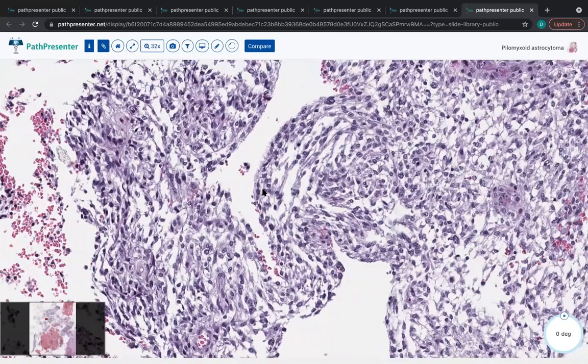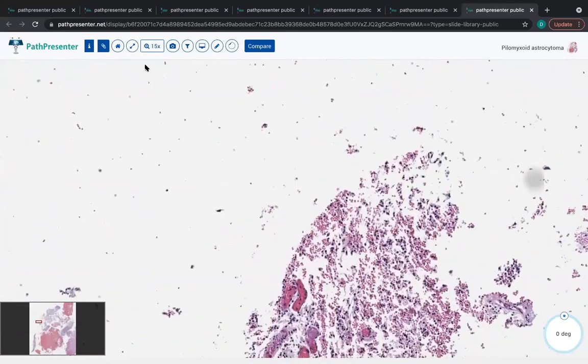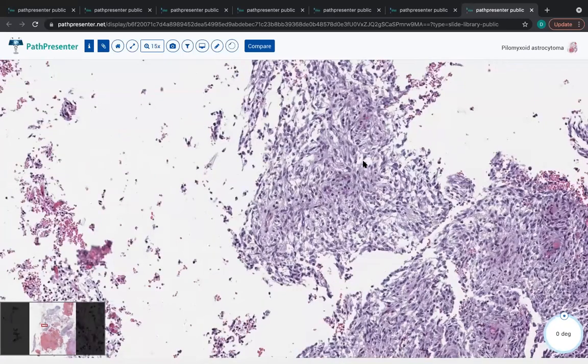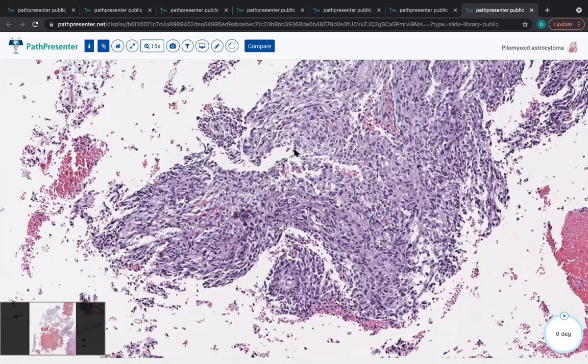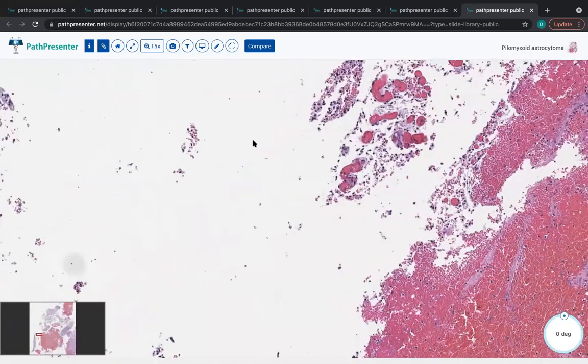Again, this is a tumor type that we probably would avoid a specific top-line diagnosis because this histomorphology can overlap quite a bit with a few different entities. And the bonus points for being specific is just not there.